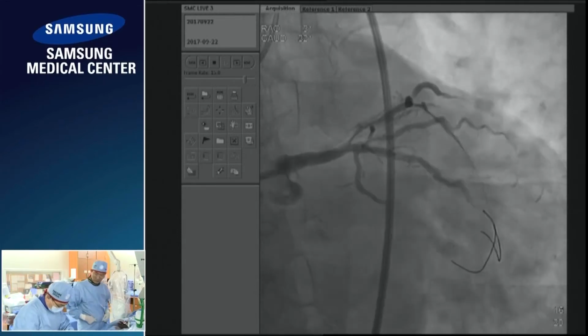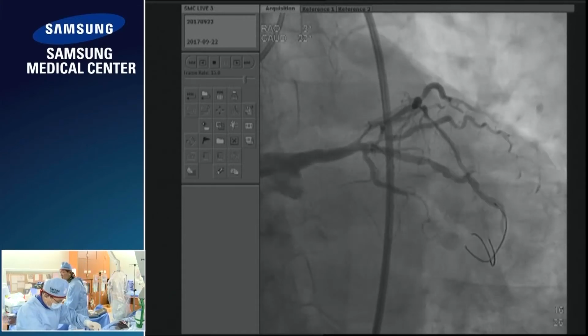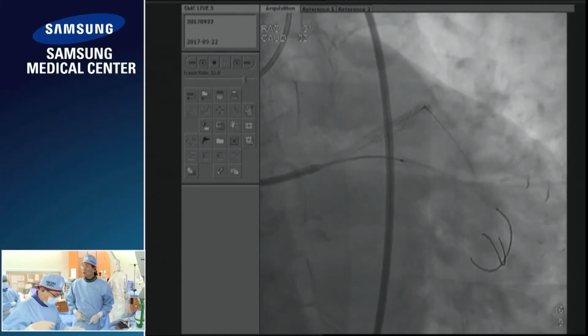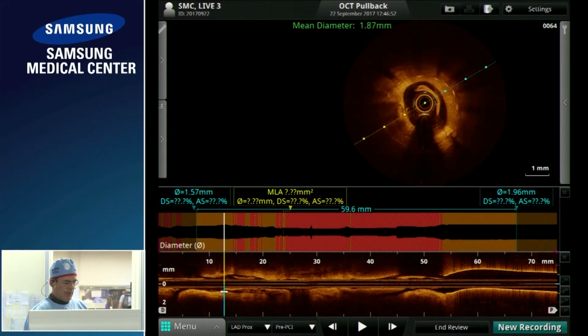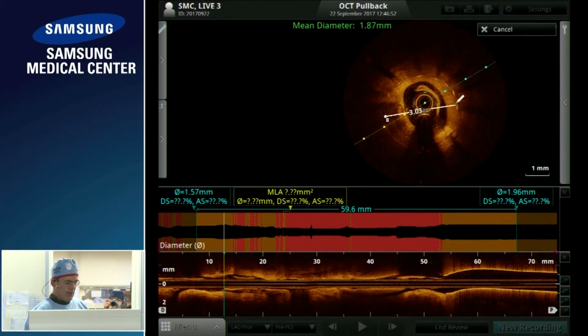Okay. So this shows actually relatively poor clearance, but I'll see what information we can derive from this. Sorry, OCT on the screen, please. Can you see the OCT projected there? Yeah, sure. Okay, well, we're in the distal lumen here. You can see, and now we're getting into the stent. So I'll give you some information about that stent size.